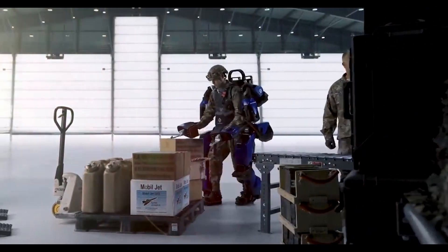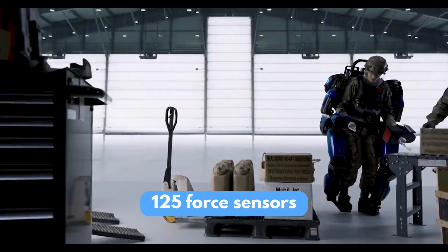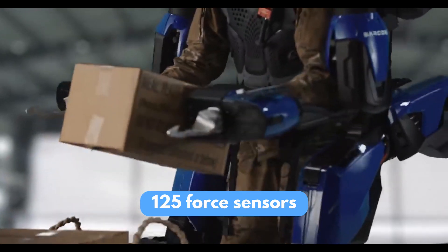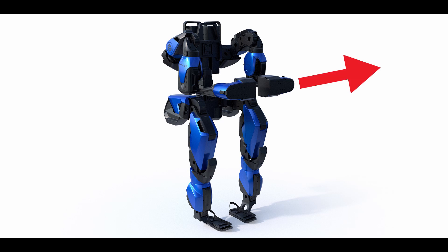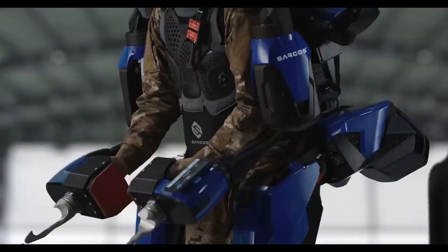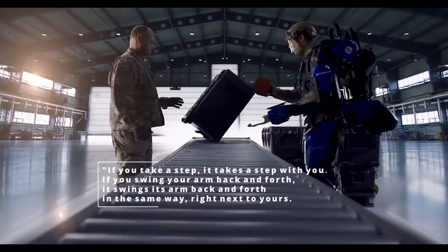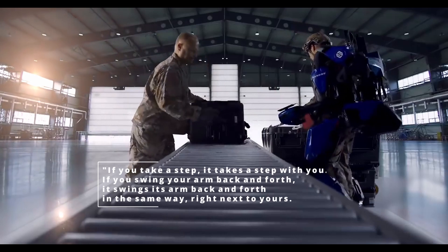The first, most intuitive idea is to simply follow the user's movement literally. A famous example is the Guardian Exo from Sarcos — an industrial exoskeleton with 125 sensors that can detect the user's movement within a millisecond. They detect linear or rotational forces, which are transduced into electrical signals and then into commands for the motors. The user's experience is reported as very fluid: if you take a step, it takes a step with you; if you swing your arm back and forth, it does too. But there is a catch — this solution assumes the user can move their limbs, which is not always guaranteed.